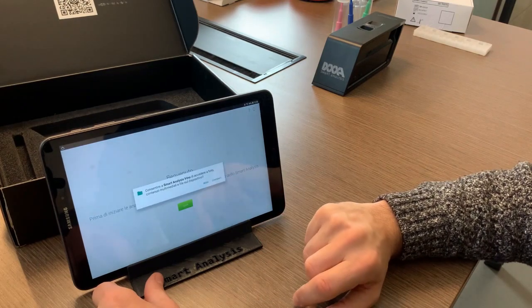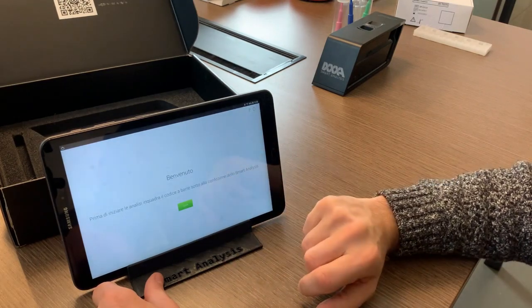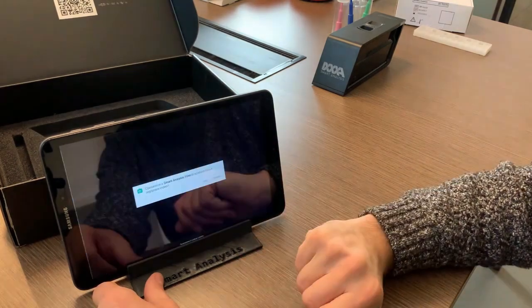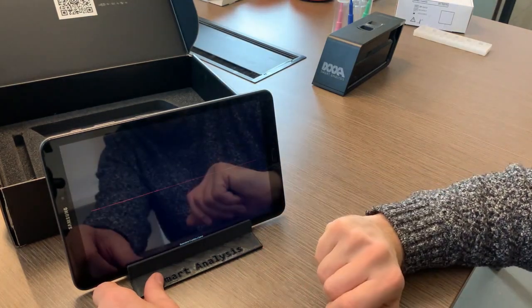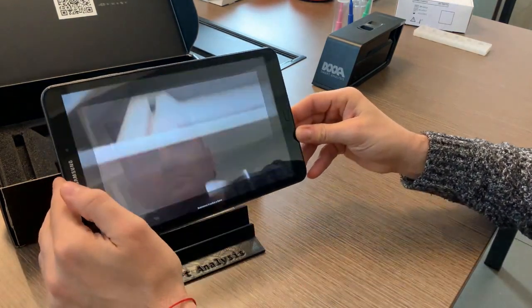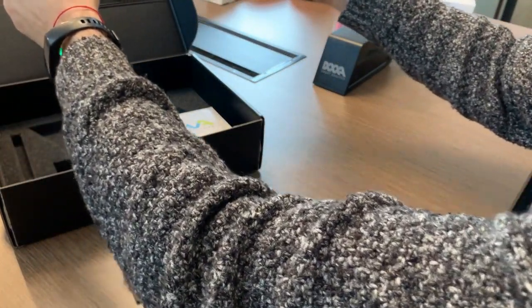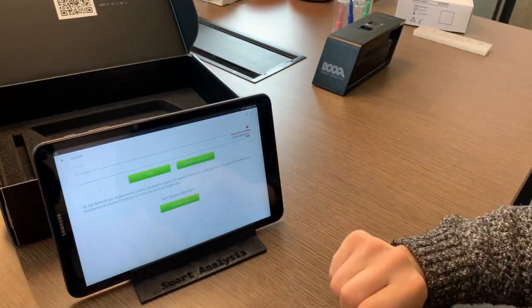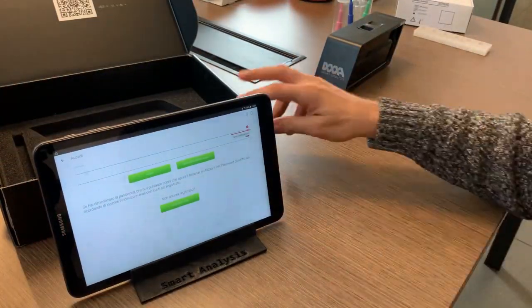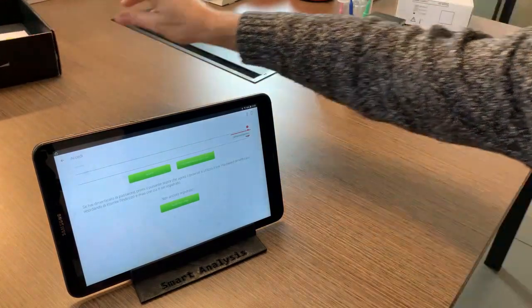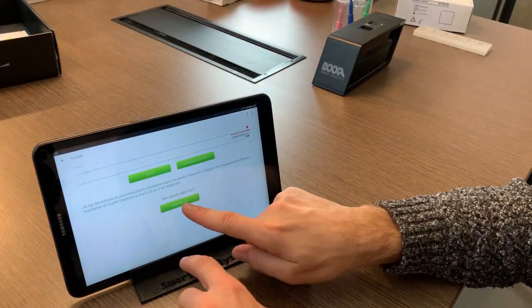The first thing it asks you to do is to activate your Smart Analysis account, so frame the QR code you find under the lid of your box and activate the application.